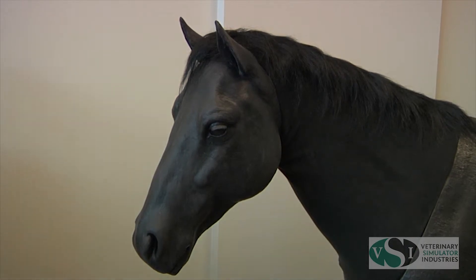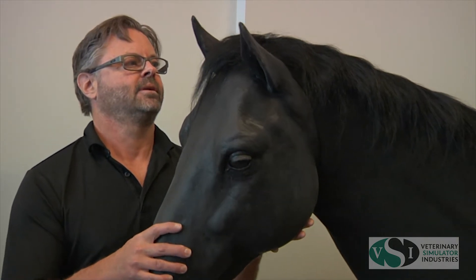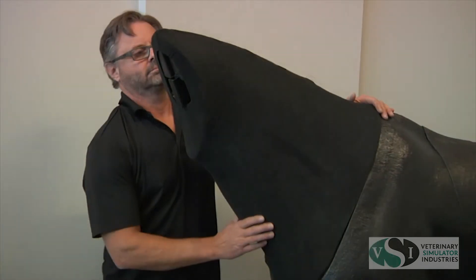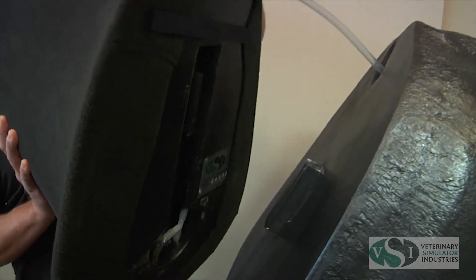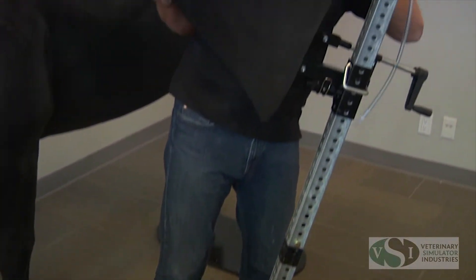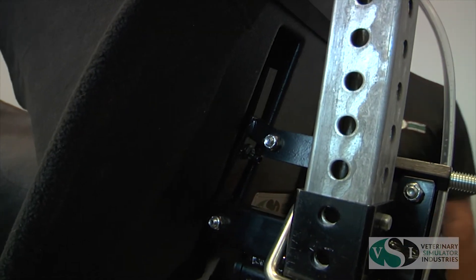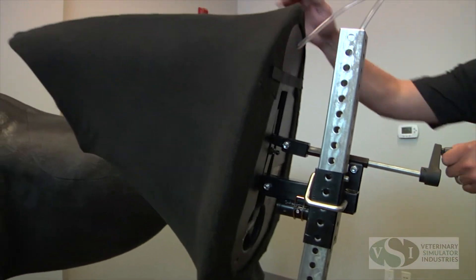The VSI Equine Colic model comes with a removable head and neck that is easily removed from the fiberglass body. To use the head and neck separate from the body, the Colic model can be purchased with the VSI adjustable rolling stand. This stand allows for height and rostral tilt adjustment.